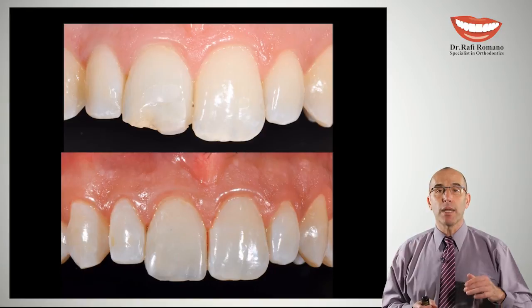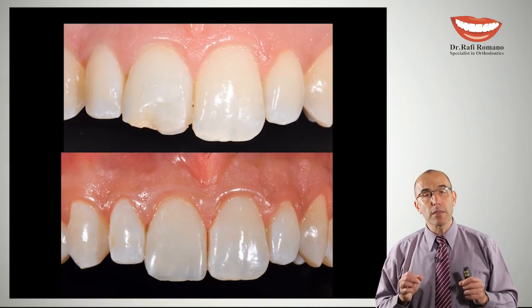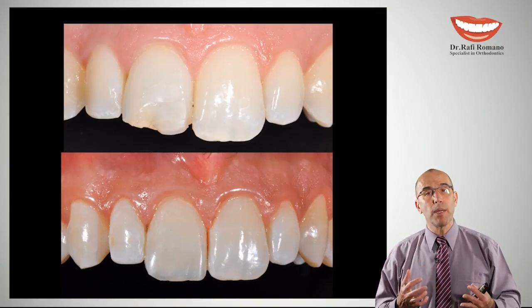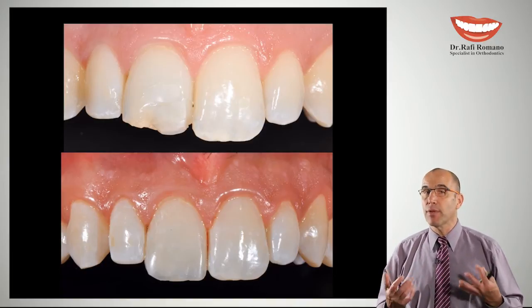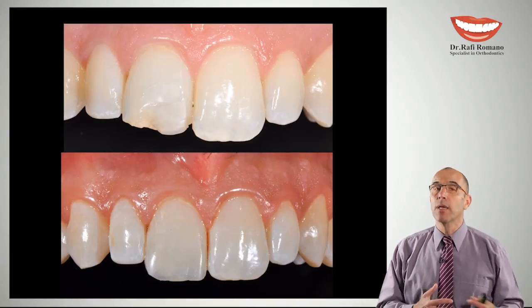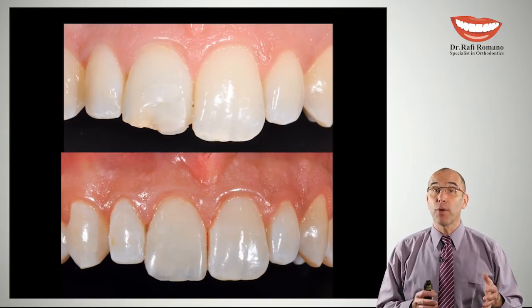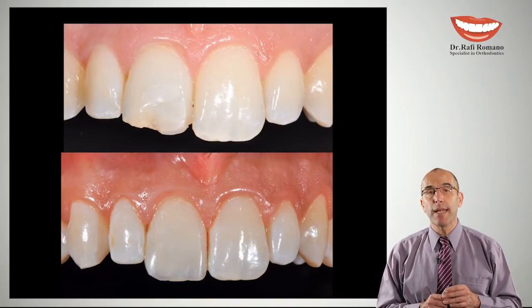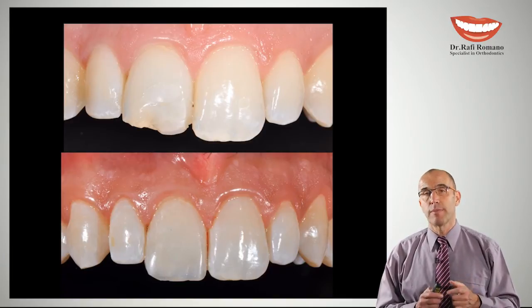You will see in the next slide a speech test I made with this patient, asking her about the problems she had or didn't have with the jaw bracket after bonding and during the whole treatment. I think it is very interesting. It is not so different from other bracket types, but it's very important for you to understand what you should tell your patient about speech problems.